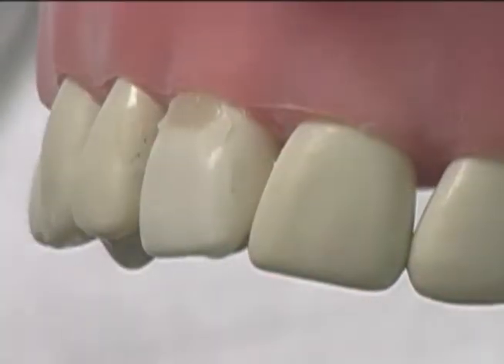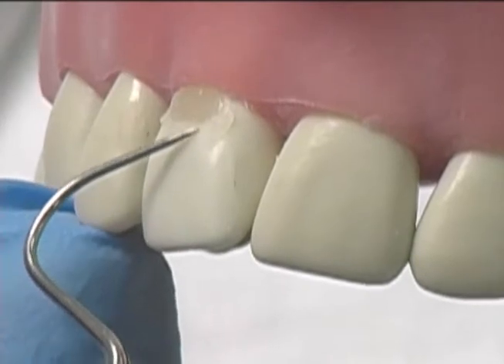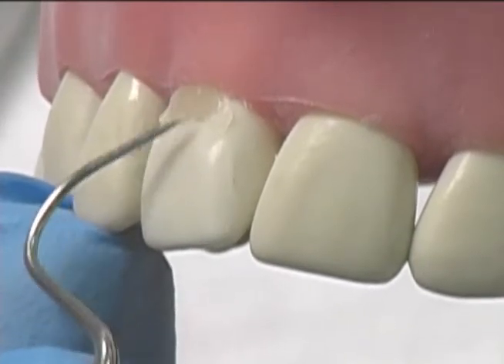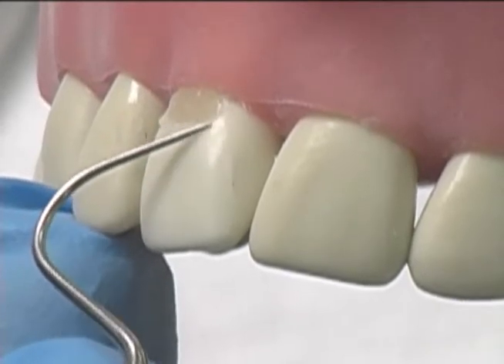After the third layer is cured, we can inspect with an explorer. I can see some margin irregularities. There's a little excess flash, a little piece of flash here. Some of these will break away.